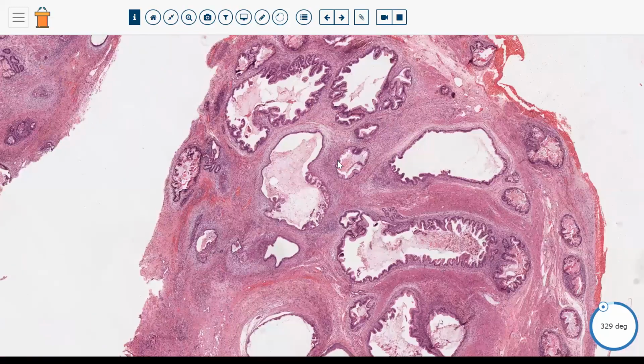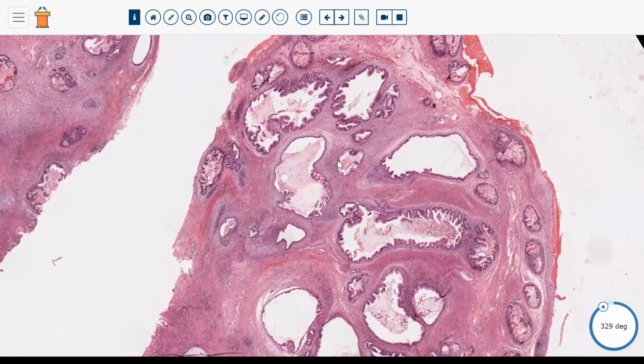You don't have as much of an organoid architecture, where you have a central lumen and glandular structures feeding into that lumen and smooth muscle arranged around the wall of that structure. If you have cytologic atypia, that's basically incompatible with a benign prepubertal type of teratoma. If you have GCNIS, germ cell neoplasia in situ, in the background, again, that's fully incompatible with the diagnosis of a prepubertal benign type of germ cell tumor.